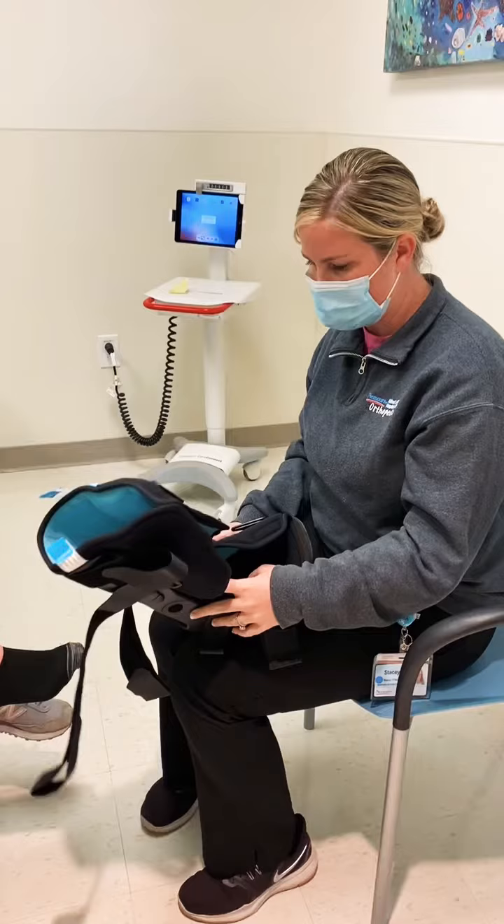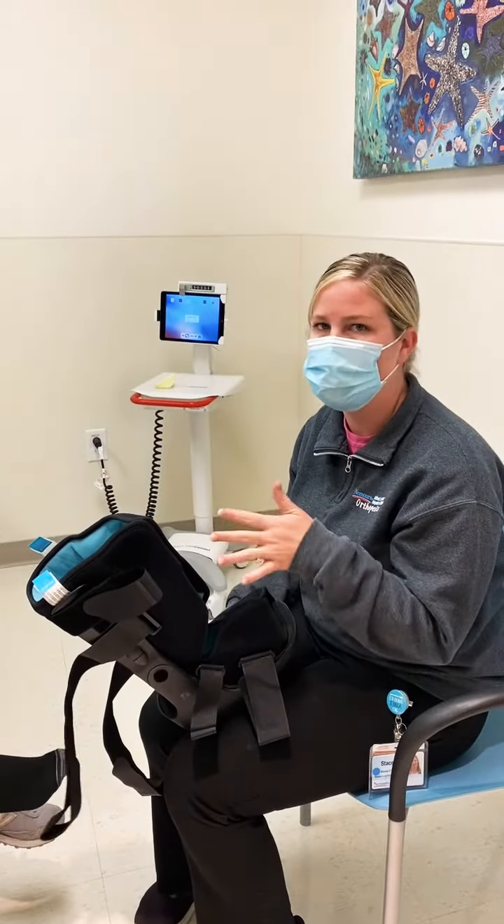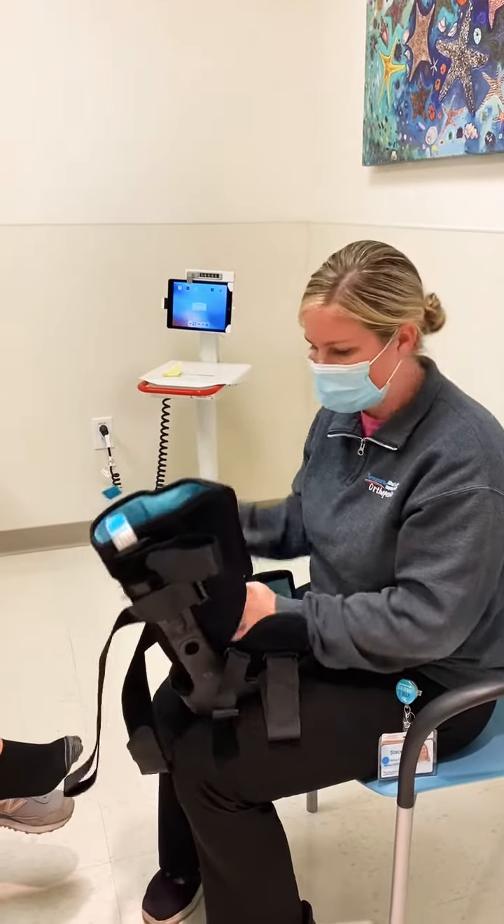You can find the size based off the shoe size of the patient, but I would recommend bringing in two sizes based off their shoe size because it's not always completely accurate.